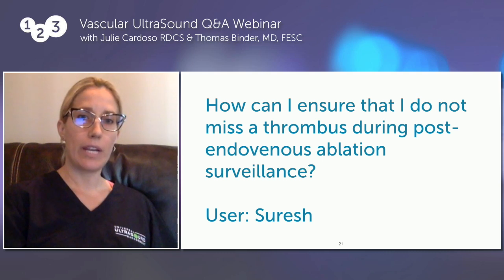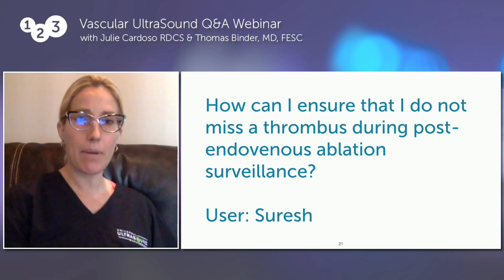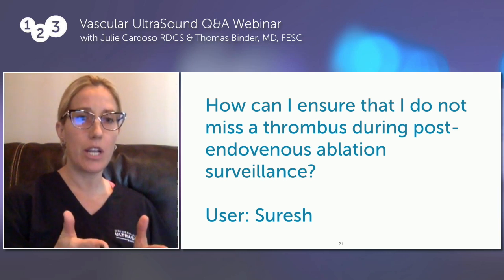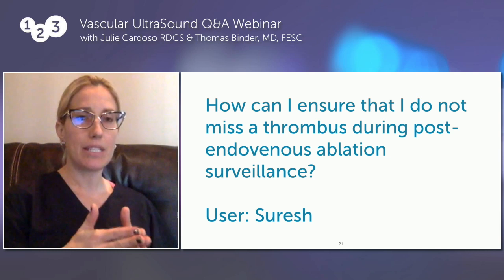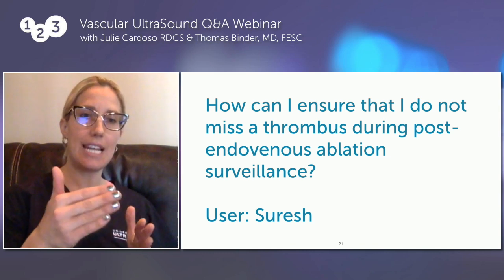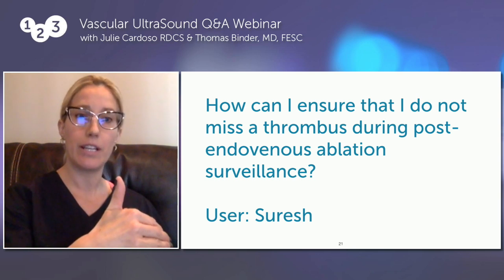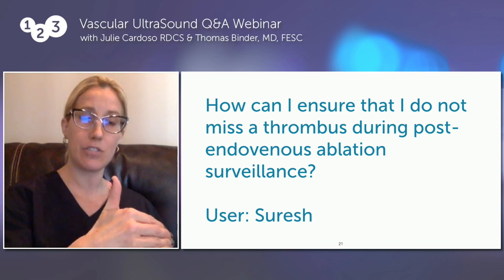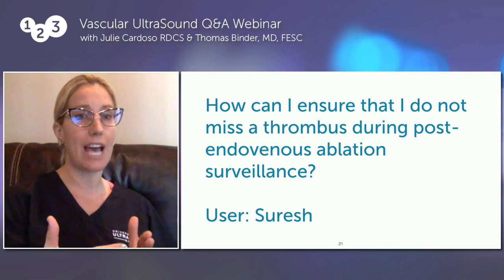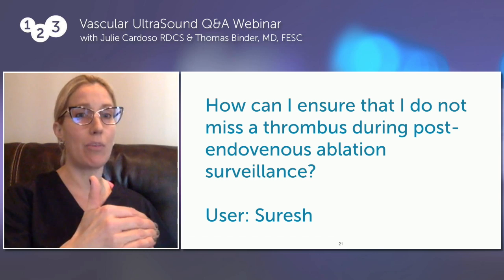Yeah, this is a very important question, and thank you for this. It's important that we assess the deep system first, to make sure that it's patent, but also whatever vein was treated with an ablation, and where the termination point is. Because sometimes when they use heat to ablate a vein, there's something called an EHIT, which is an endovenous heat-induced thrombus extension. What happens is that this extension goes into the deep system, whether it's through the saphenofemoral junction from the great saphenous vein or the anterior accessory saphenous vein, or if the small saphenous vein was treated, sometimes this extension can go into the popliteal vein at the saphenopopliteal junction.